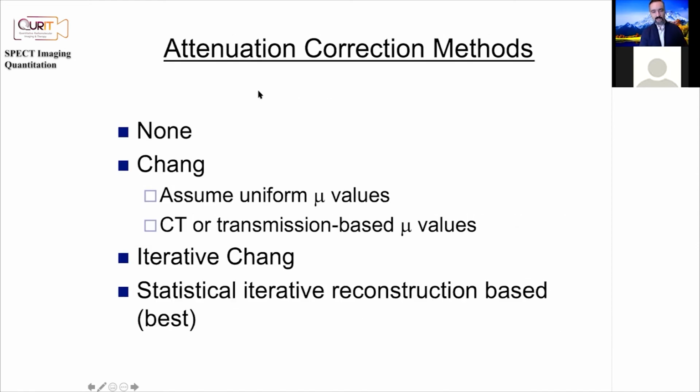So just to summarize, attenuation correction methods have been as follows: doing nothing, and just having the physician and the radiologist adjust their thinking as they look at artifacts and things like that.